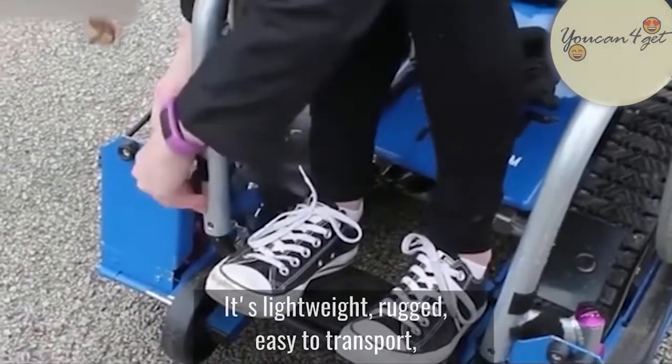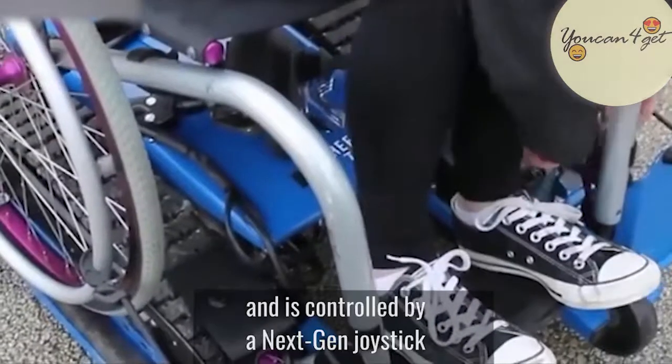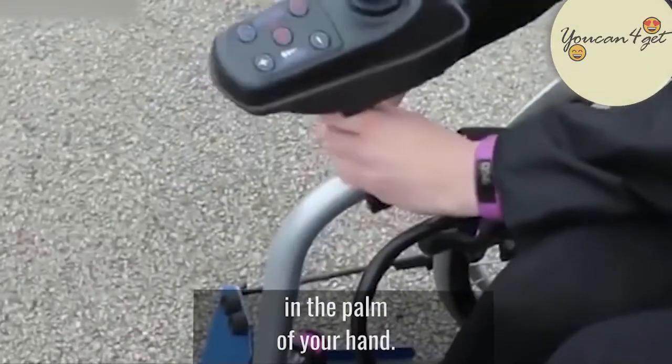It's lightweight, rugged, easy to transport, and is controlled by a next-gen joystick in the palm of your hand.